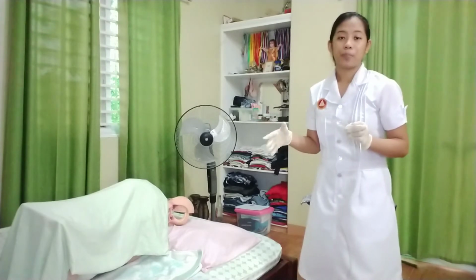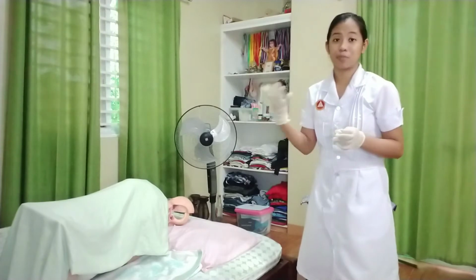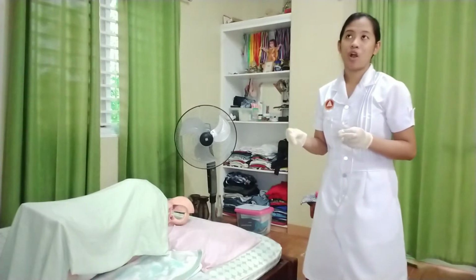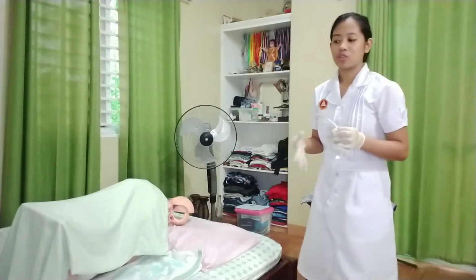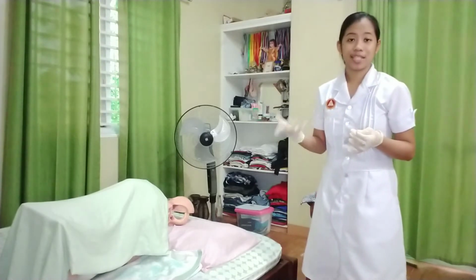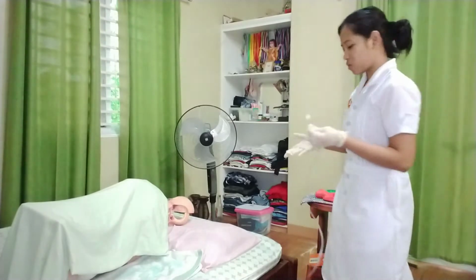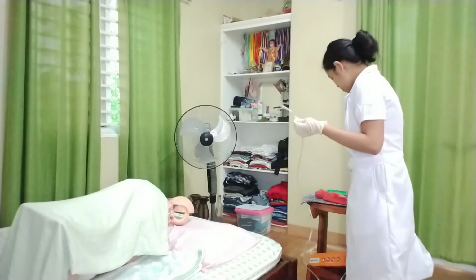But if it doesn't work, then withdraw the tubing, check if there is any feces present, and if there is any, withdraw the tube and flush it, and then retry the procedure. So if all of that doesn't work, then do not do the procedure at all, and report the resistance to the primary care provider or the nurse in charge. So I will now be administering the tube.